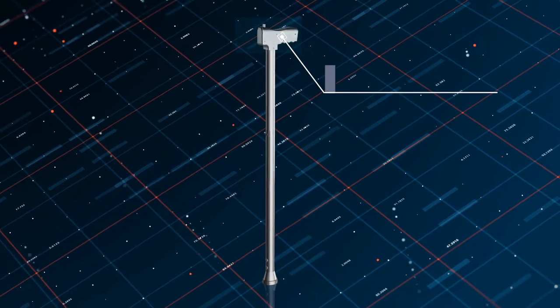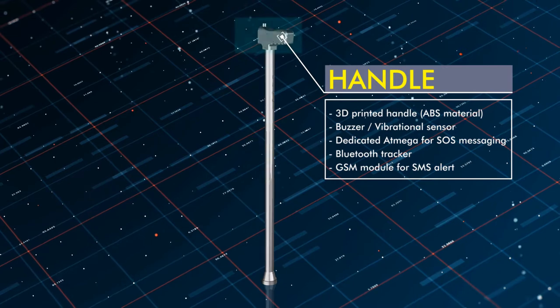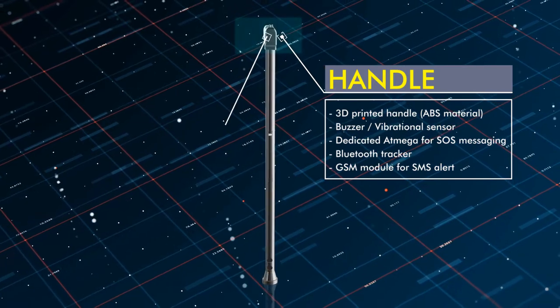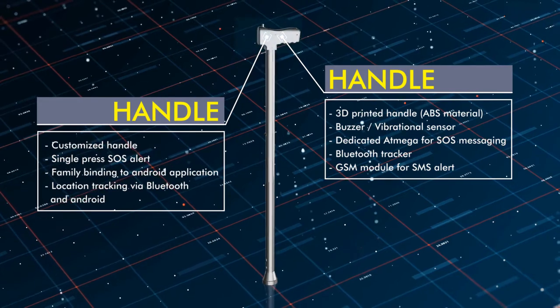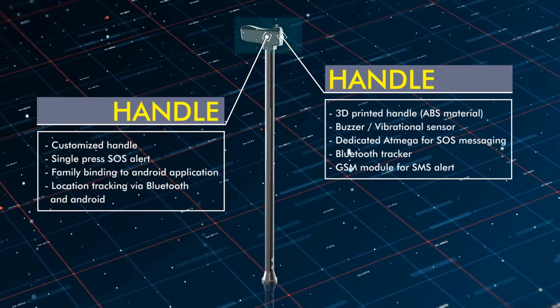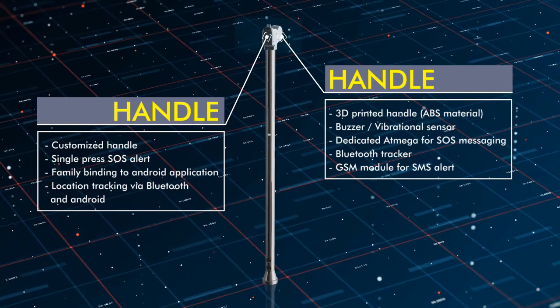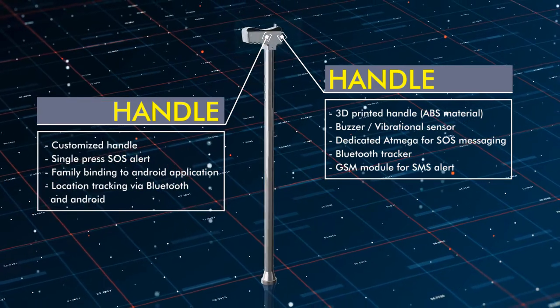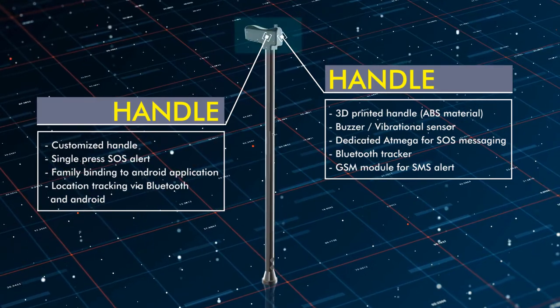The handle is 3D printed — we can use either PLA or ABS material. For my current prototype I have used ABS material. The handle can be custom built by taking different parameters, such as whether the user uses their left hand or right hand, or has different hand sizes, making the system more comfortable and smooth in usage.